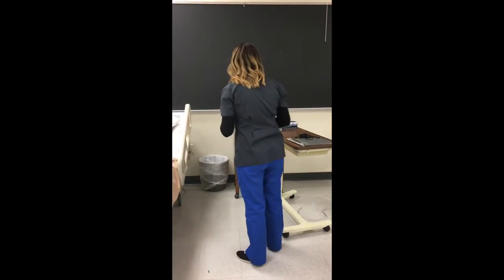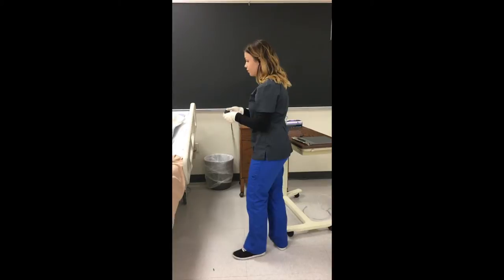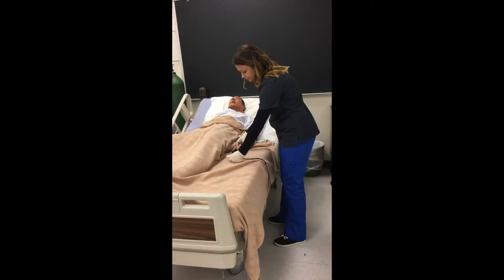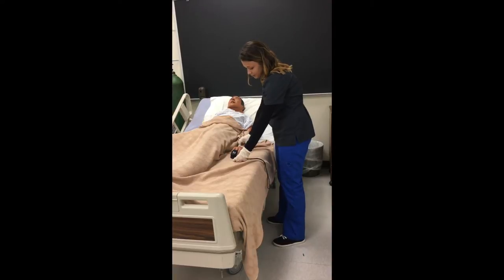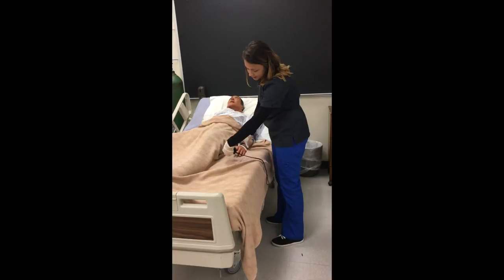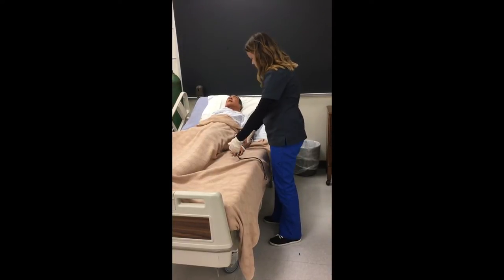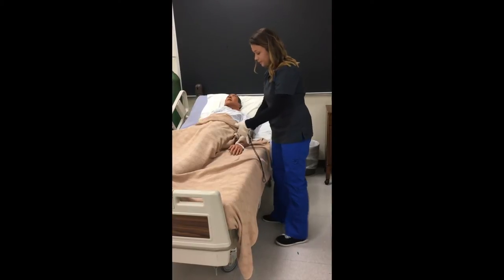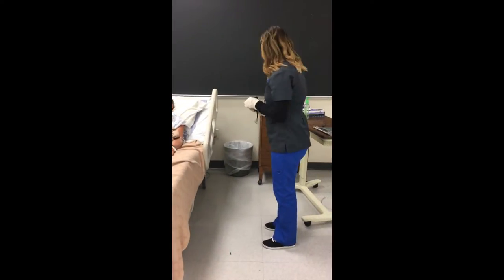Now that you have been having your therapy for a while, I'm going to go ahead and put on the pulse ox to see how well it's doing. I'm also going to take your pulse. Your pulse ox did increase up to 96, which is really good, your pulse is still normal, and your respirations came down a little bit, so that's good.